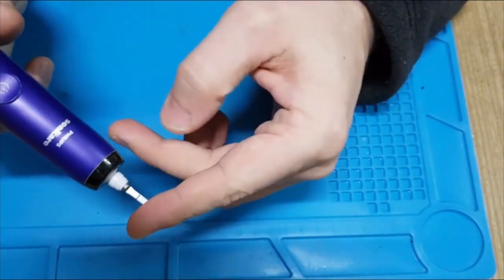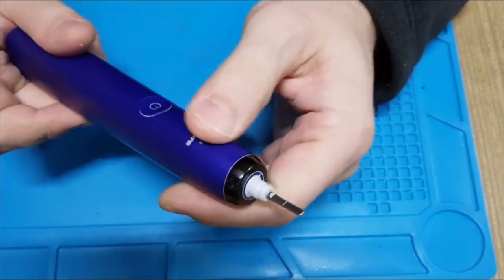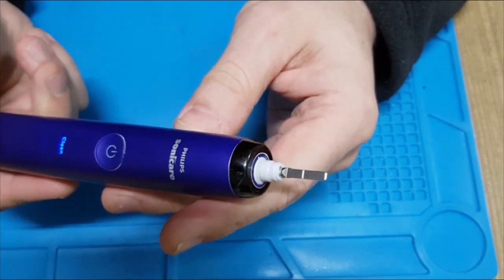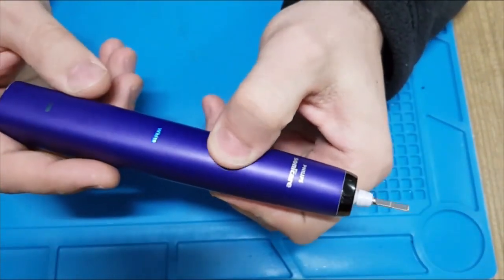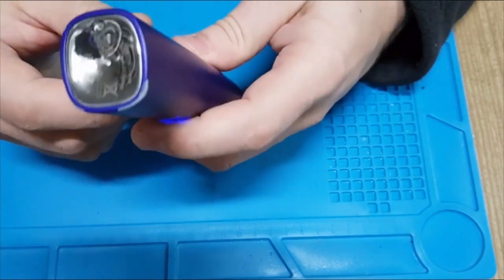If you drop it on the end, the magnet will get closer to the electromagnet and it will not work correctly, like this one. You can hear that there are almost no vibrations at all, but the electronics function. So I will show you my method of opening it.